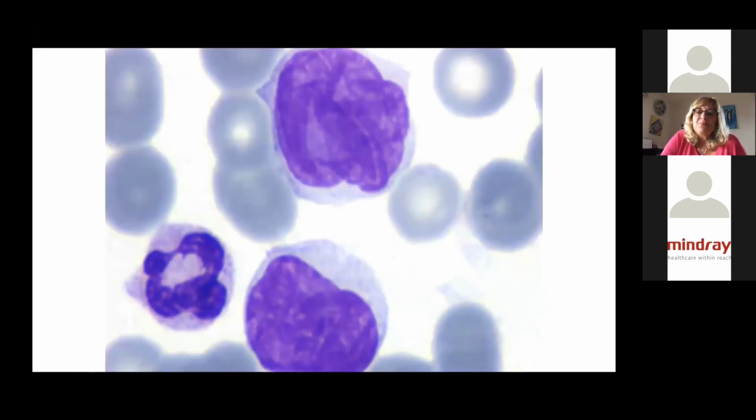The smear. What are we seeing here? These are big lymphoid cells, but with a very particular irregular nuclear profile, and with these lines in the nucleus. It is a mature chromatin, but with several lines inside.